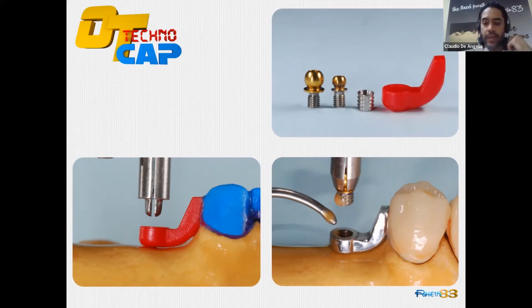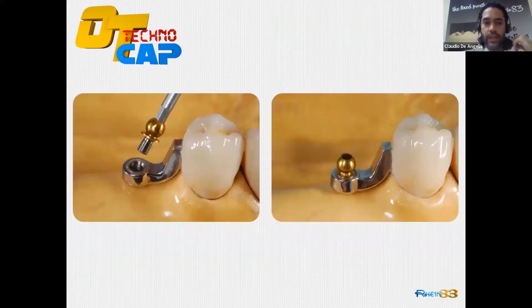Remember this flat surface, and this is my attachment after I glue inside the hole of my arm the threaded sleeve. I can remove it and I can replace it in case of wearing, in case of damage. I can always recover my system over the years, okay?